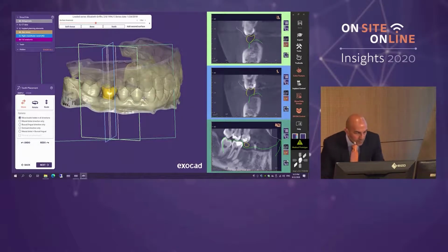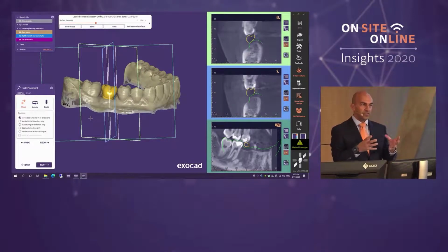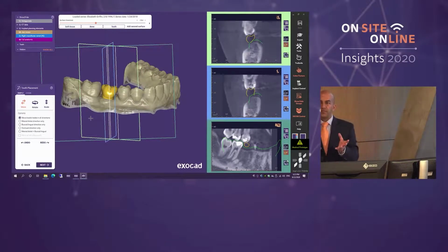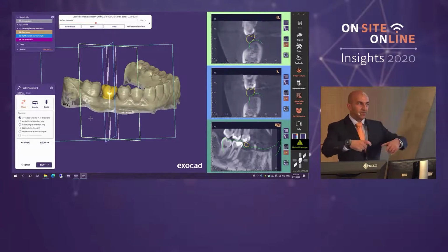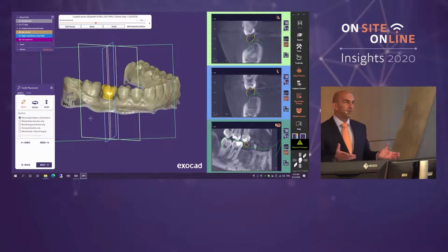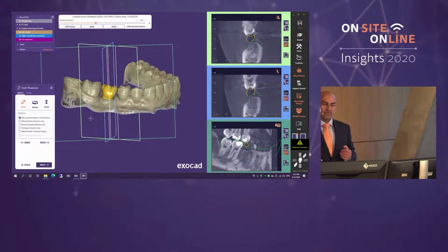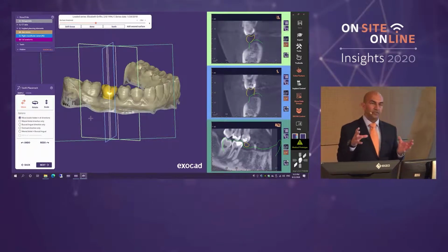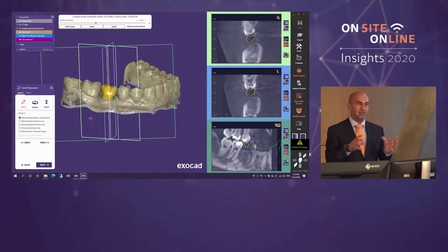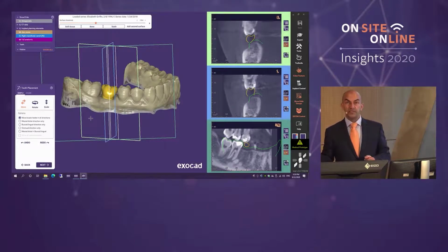Okay. So there are many colleagues still who are asking their laboratories to cast an impression, produce a stone model, wax up a tooth on there, and then on that they suck down a stent, and they use these kinds of processes to go ahead and design where they may or may not be able to place an implant. I haven't done that for more than 10 years, probably 15 years, because of this kind of data, where you're not placing an implant where a technician can make a tooth look really sexy with wax. You're placing an implant where the bone exists, and if the bone doesn't exist, you can then plan to do some grafting.